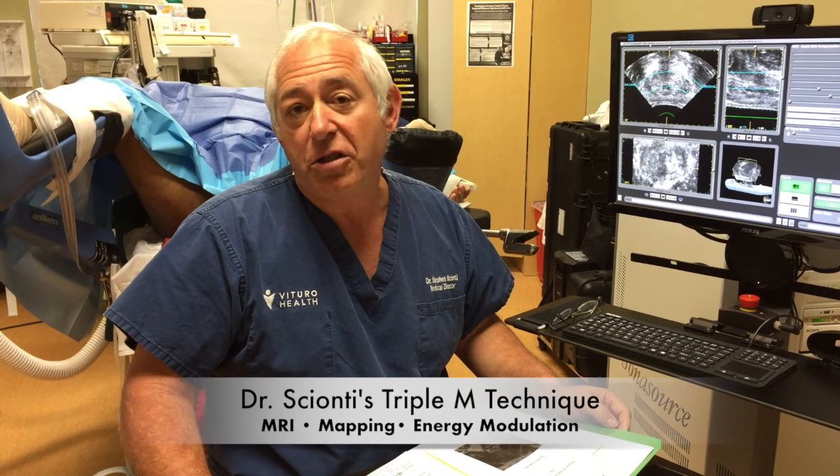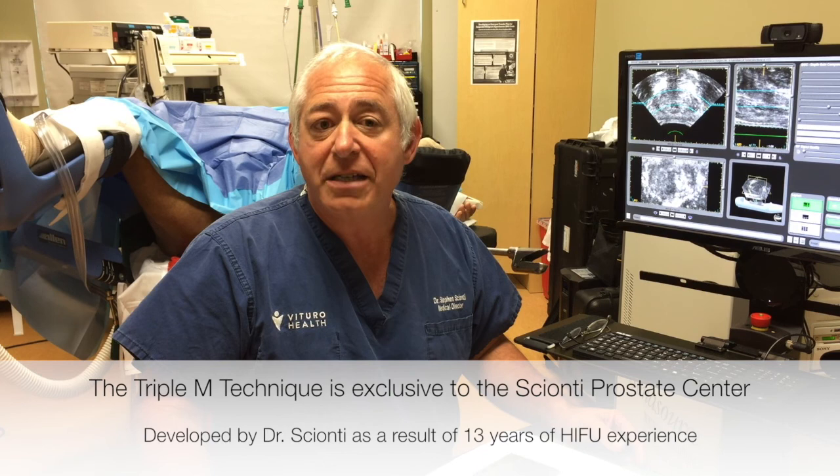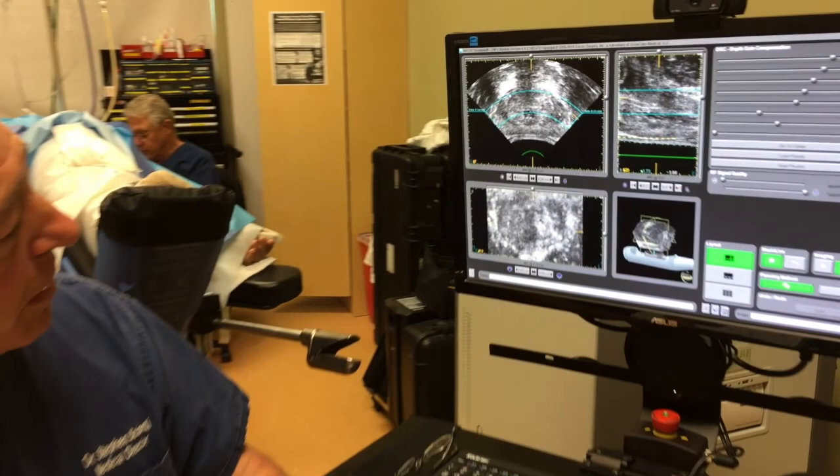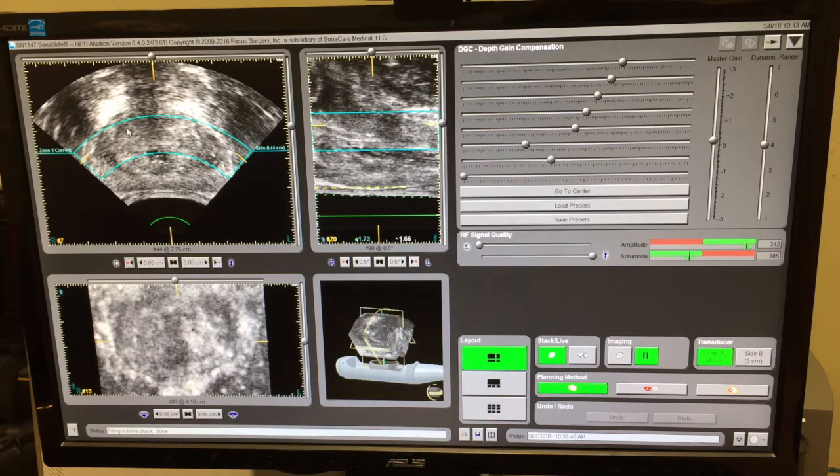Today I want to show you a technique in which we use MRI mapped energy modulating therapy to provide excellent ablation of a very high-grade tumor. Our patient today is 54 years old, he had an elevated PSA, and he was found on biopsy to have a Gleason grade 7 prostate cancer. An MRI demonstrated a large tumor based in the anterior or upper part of the prostate. On the ultrasound screen of the Sonablate device, it's not very clear where the tumor is, but the tumor was located in the upper part of the prostate on the right side. This is where the MRI is going to be very helpful today.